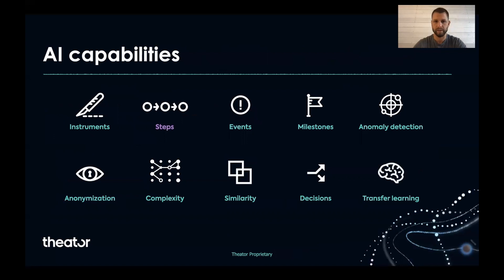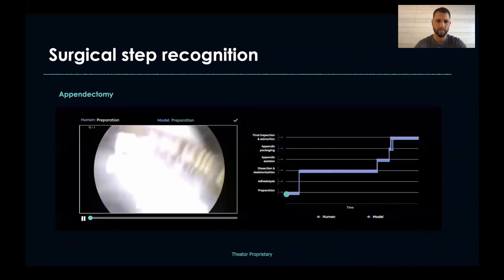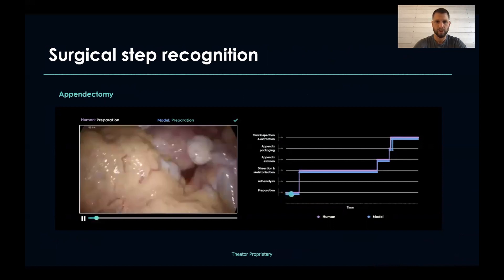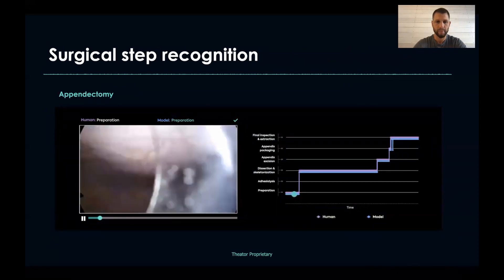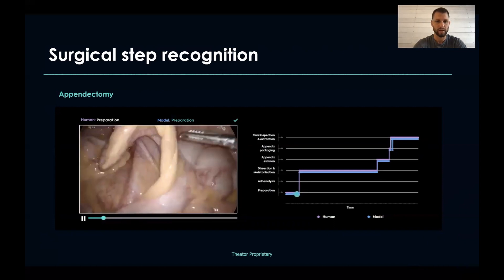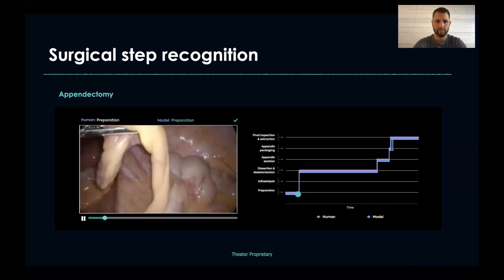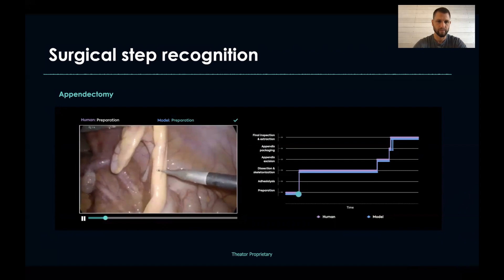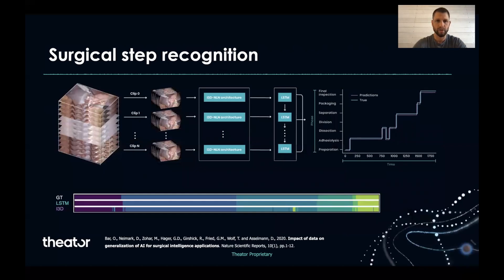Another important task is step recognition. What we want to do is detect for each second in the video which part of the surgeon workflow it comes from. Here is an example for appendectomy — we see the video running fast forward. On top, we have both the human annotation and what the model predicted. Once we get to a transition step, the video slows down. We can see that when a tool enters from the right, both the model and soon after also the human will update the step. Similarly to out-of-body detection, we take the full video, break it into clips, process it with a 3D component, and here instead of a binary head, we have an RNN like an LSTM that processes the entire feature vectors and gives us the prediction for each second of the correct step.